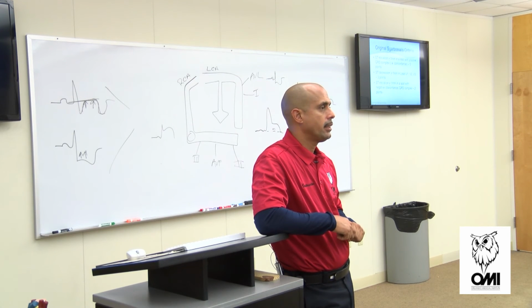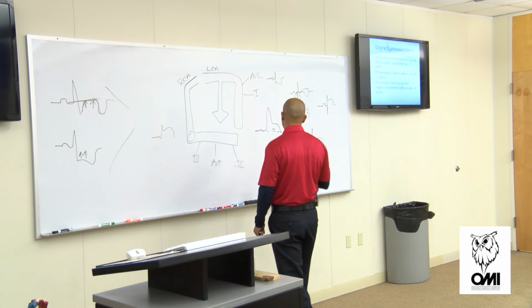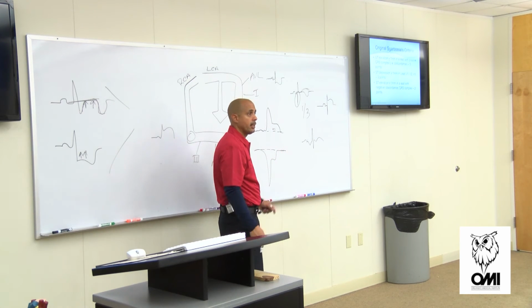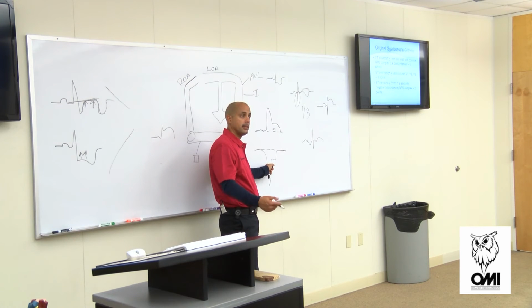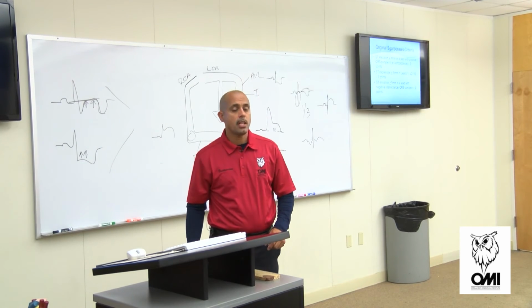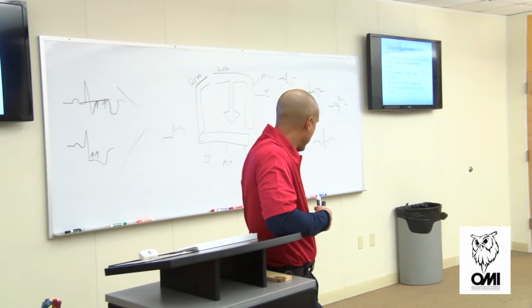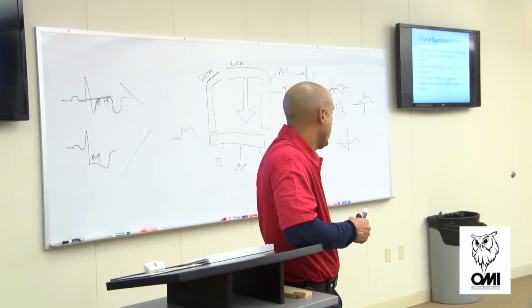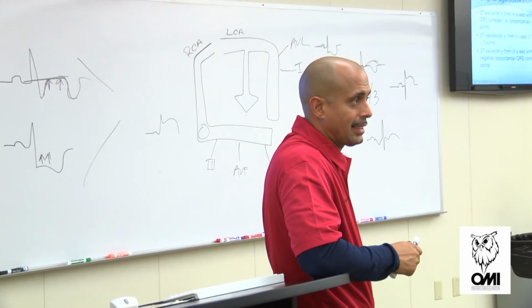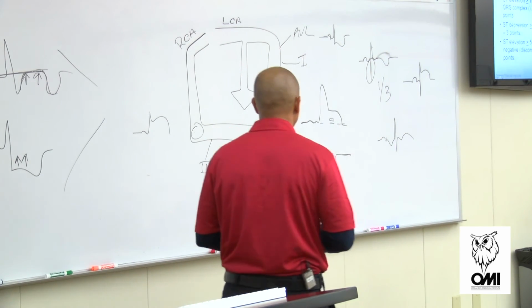Does everybody understand that? If I had ST depression and my QRS on the same side, are we on the same side? So that's also what? Anybody? Concordant. So since they're both concordant and they're 1 millimeter more, they both weigh at 5 points. That one weighed at 3 points. 5 points was the first one, elevation. This weighed at 3 points. But it said if it's 3 points or more, it was actually a high index, a 90% chance it was an MI. All right? And then this concordant, which would be this one.